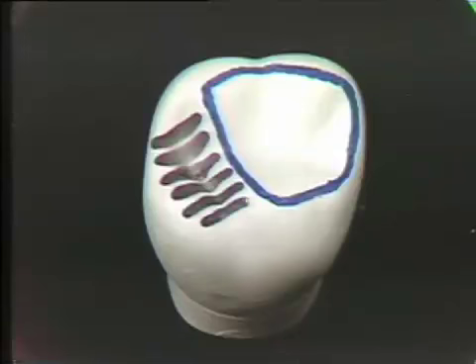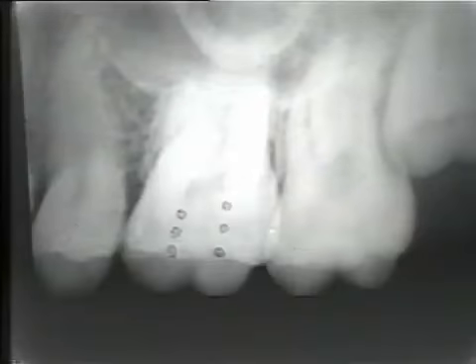The maxillary molars show a slight variation from the principles previously mentioned. The entire crown shape is not representative of the shape of the pulp. The shape of the pulp most closely resembles the part of the crown that is bound by the mesiolingual, the mesial buccal, and the distal buccal cusp. This forms a triangular outline shape, as you can see on the model of this maxillary molar. In deciding on the shape of the pulp, you should disregard the distal lingual cusp. Test yourself on this variation.